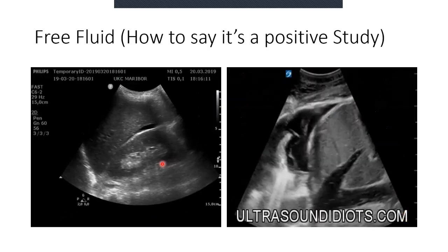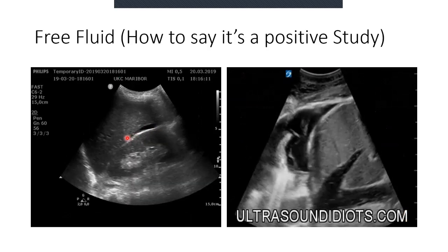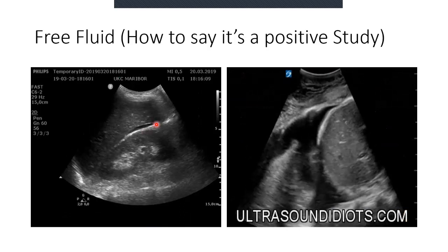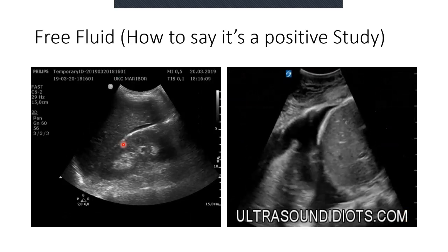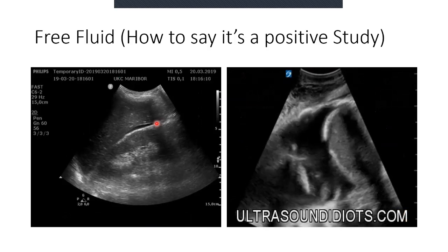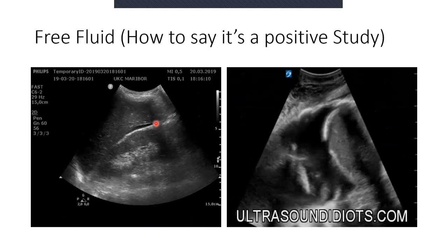So this is one with small amounts of free fluid. Now, if you are confused as to whether this is free fluid or something else, look at the angle. If you follow the angle just there, you can see it forms a sharp angle at both edges. Your patient will be peritonitic in this case, but this is a positive study. But you can see it's such a small amount that if you don't scan through the entire liver, you may not get everything.